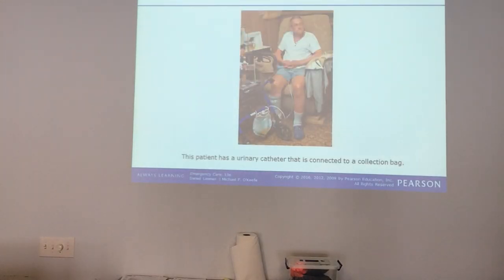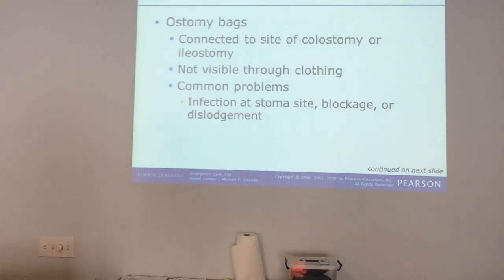Here's a good example. This guy has a Foley catheter, it looks like, and it's secured there to his leg, runs up into his penis, and then down into the Foley bag down here. It keeps it off the floor, but keeps it lower than where it attaches to the patient.